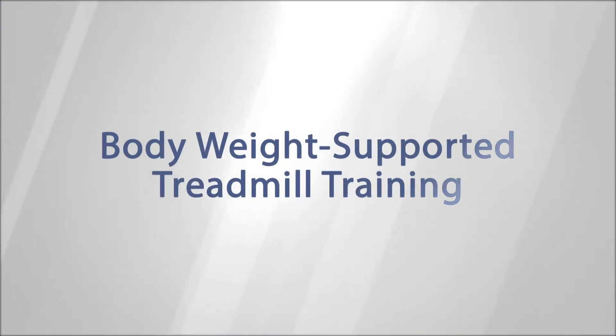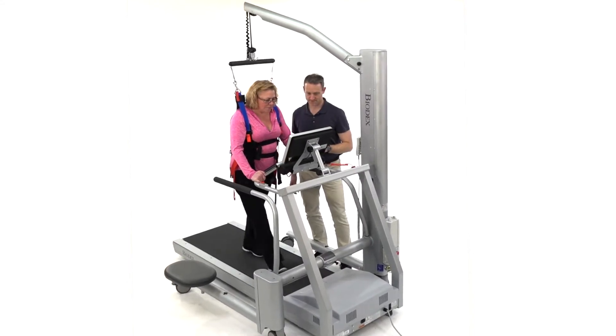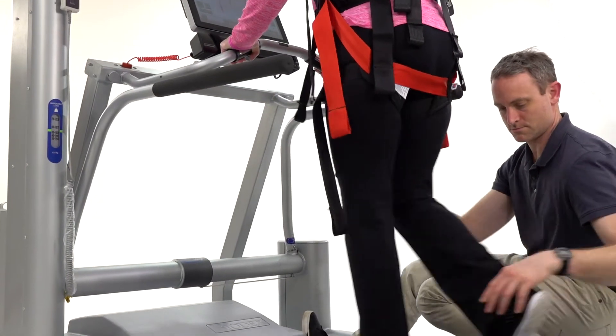Body weight supported treadmill training is a valuable form of therapy for neuro rehabilitation, enabling functional ambulation training in a safe environment.